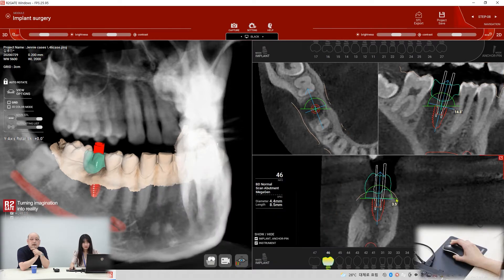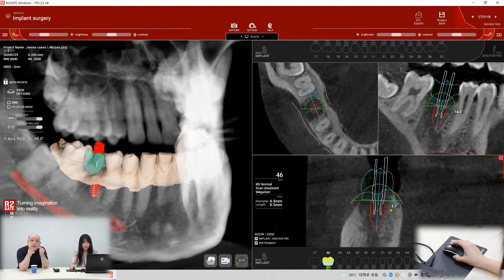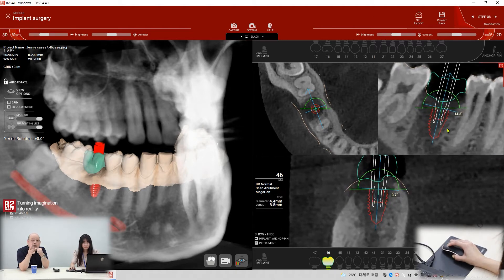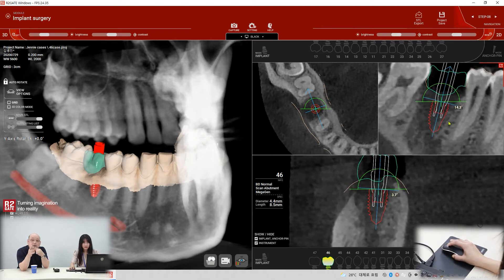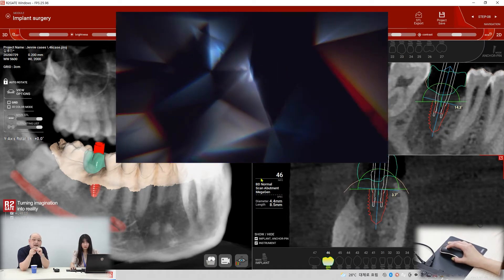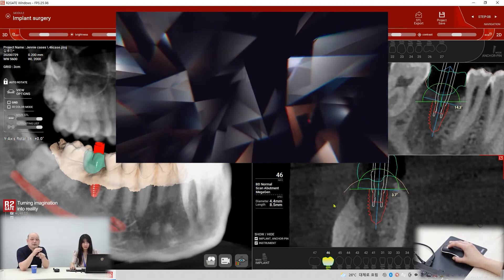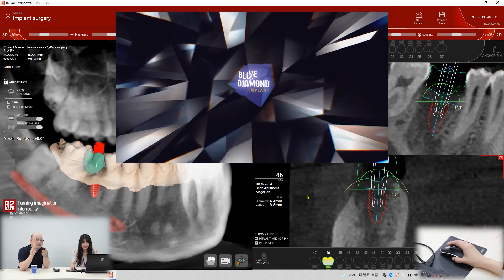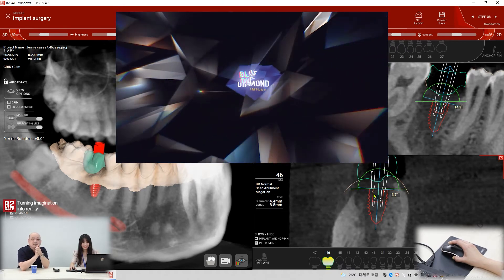So that red line is the implant, right? The red line. So which implant is it? Blue diamond. Okay, that's the new implant — the MegaGen implant.